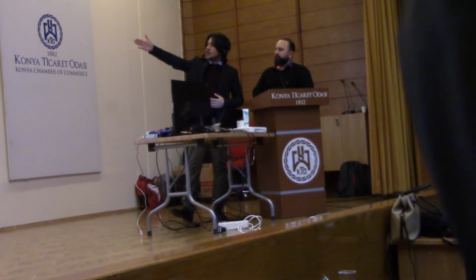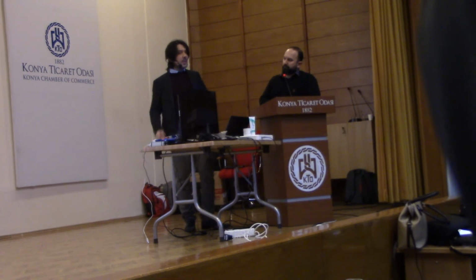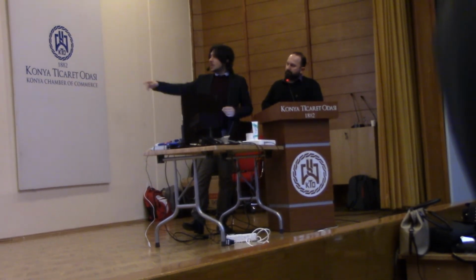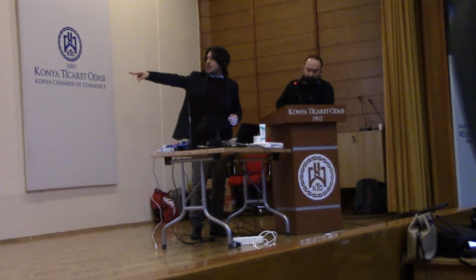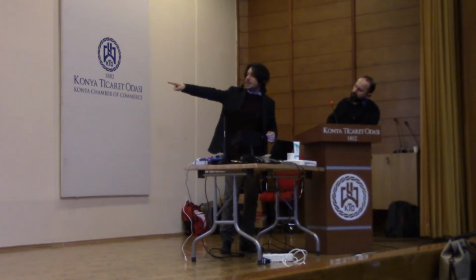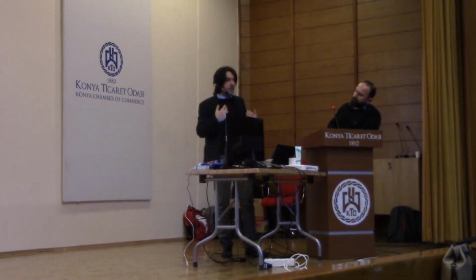power line noise. You can see the black ones. It's 50 hertz, and the harmonics of this kind of disturbance enter into the band of your response. The band of the response is the blue one. You see, typically it's in that area over there, and in the lower frequencies, the interferences are the electromyogenic ones. Okay, that's why it's important that your patient is quiet.